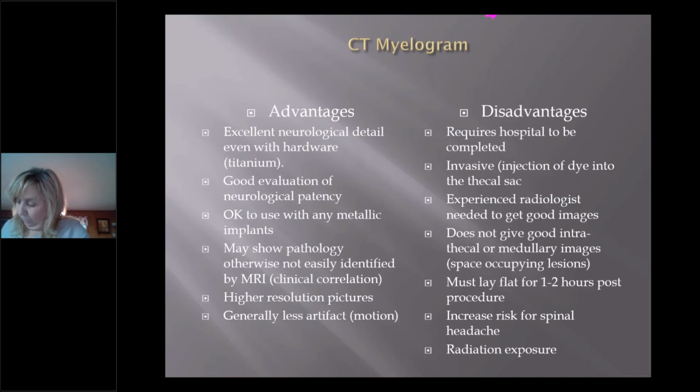Now that I've sung praises of it, there's some disadvantages. Got to do it in a hospital. It's not an outpatient imaging thing. They don't have to spend the night, but it has to be done in a hospital. I don't know any outpatient centers that do them. It's invasive, meaning they got to get a needle stuck into their intrathecal space, not epidural space, intrathecal space. So it's going into where the CSF is.